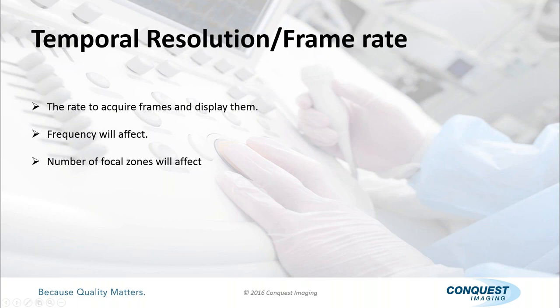And in reality, is that a good thing or a bad thing? It's really up to the sonographer to tell you, or for you to see. When imaging a phantom, there's nothing really moving, so the refresh rate is less important. But if you're looking at some object that's moving, it could start to appear choppy if you put too many focal zones in there.